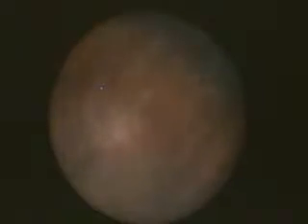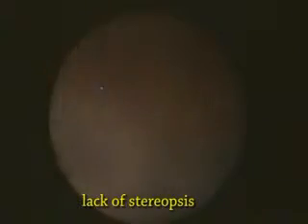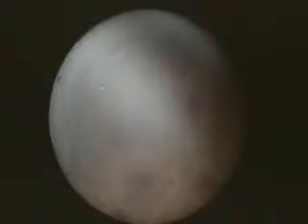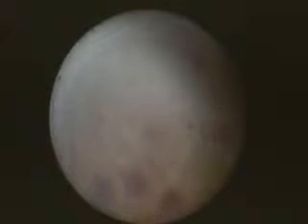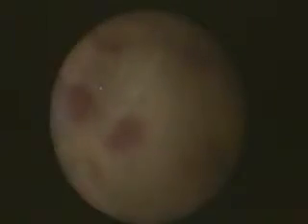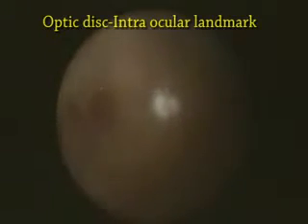In addition to the learning curve, another challenge of endoscopy lies in the loss of binocular stereopsis. Shadowing is also eliminated because the light source and the camera are on the same axis. Awareness of instrument location within the globe therefore relies on monocular clues such as the size of the landmarks, intensity of illumination, and change in focus.